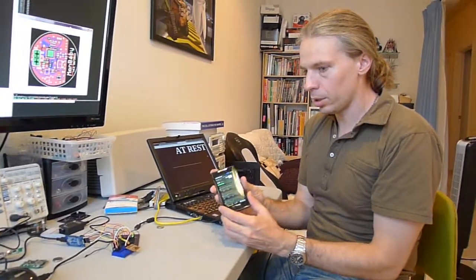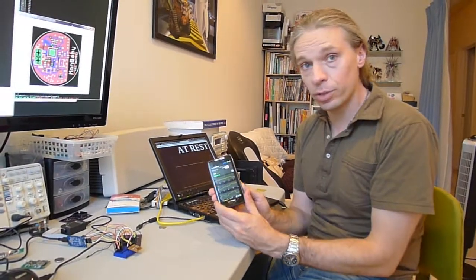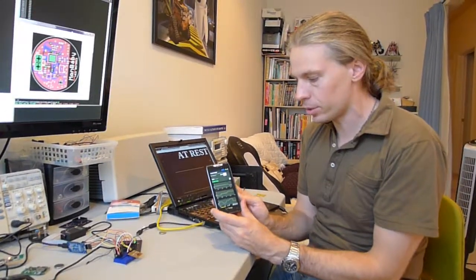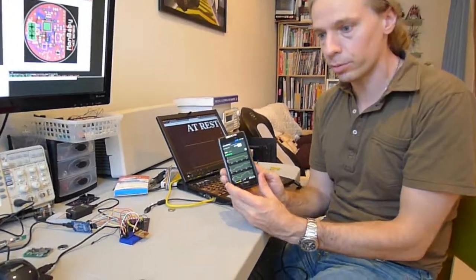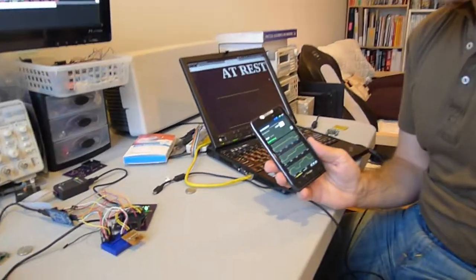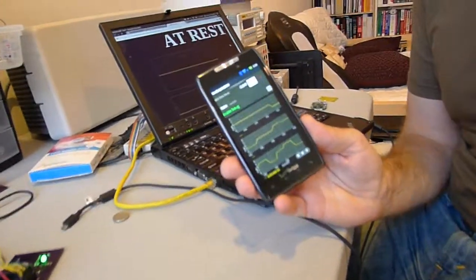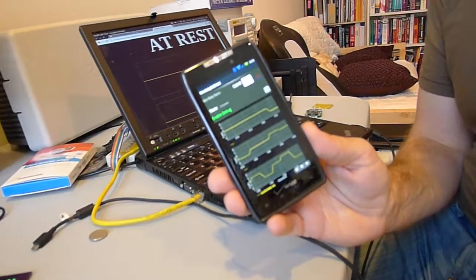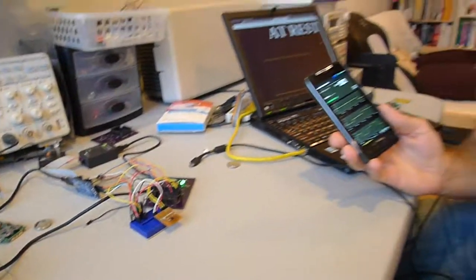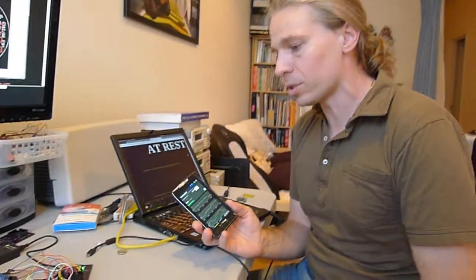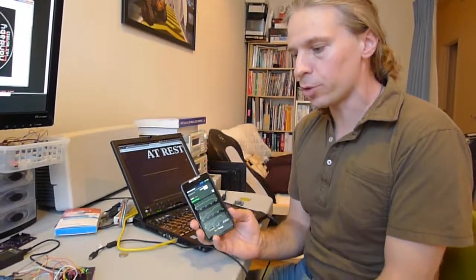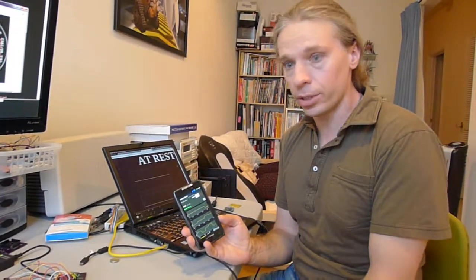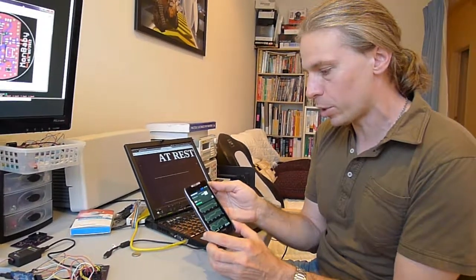to your smartphone device. In this case, this is a Motorola RAZR DROID running Bluetooth Smart, and it communicates with the CC2540 Texas Instruments chip that sends the signal measured from the Freescale accelerometer to a smartphone.